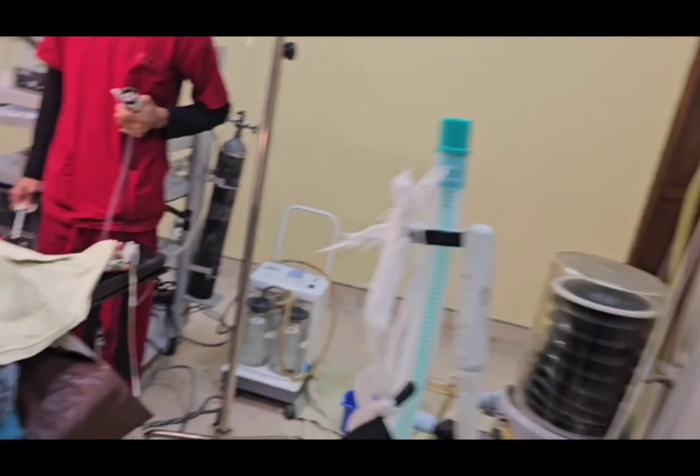We are now done with the operation. The operation is successfully over. We are turning off the isoflurane gas. We will turn off all the gases — the volatile agent and the nitrous oxide — but the oxygen will remain. The nitrous oxide is turning off, the oxygen is going to a high level, and we will maintain that.